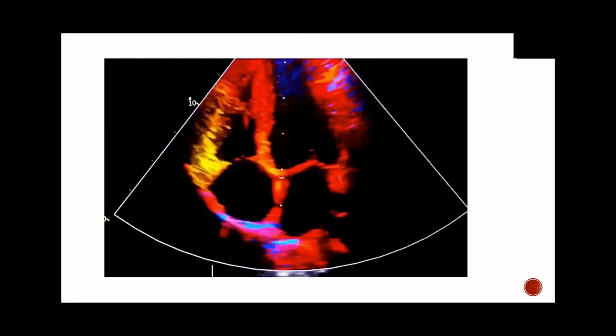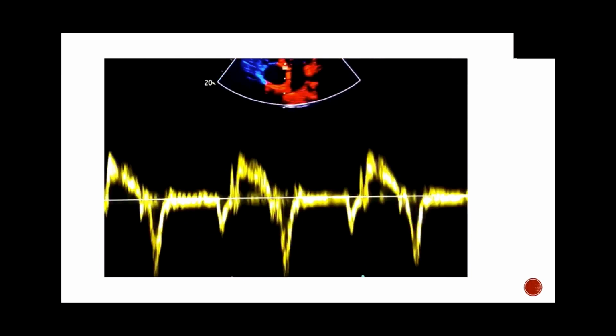All right. So let's move on to tissue Doppler. Tissue Doppler is a function of the machine. Normally in pulse wave Doppler or continuous wave Doppler, it is looking for high frequency, low amplitude velocity, things that are moving very quickly across the valve. But by adjusting and placing on tissue Doppler settings, it's going to try to isolate out the lower frequency and higher amplitude waves. So tissue that moves slower.